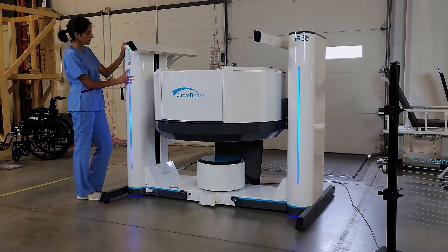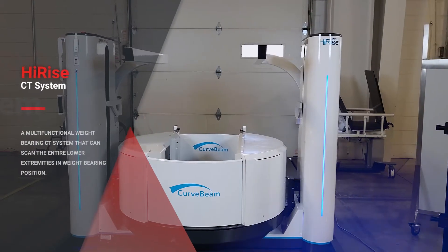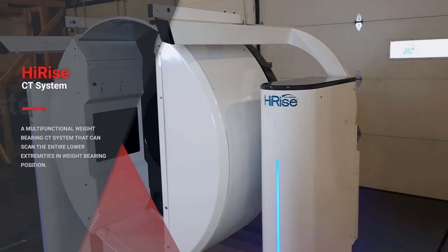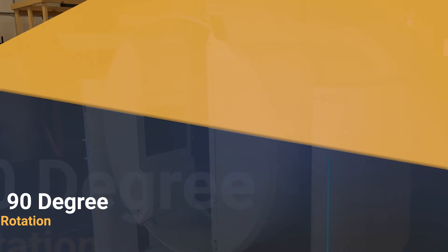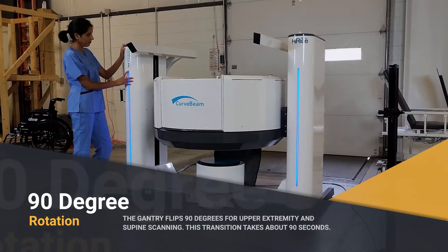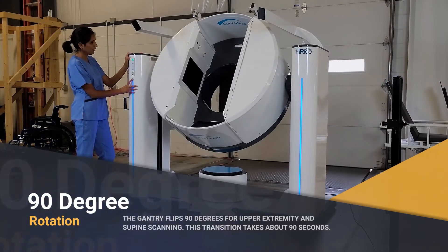CurveBeam offers two solutions for CT imaging of the upper extremities. The HiRISE is a multifunctional weight-bearing CT system that can scan up to the hip and pelvis. The gantry flips 90 degrees for upper extremity and supine scanning, and this transition takes about 90 seconds.